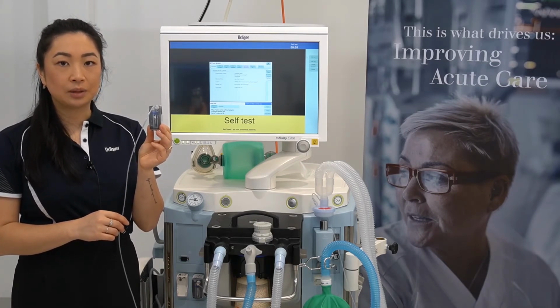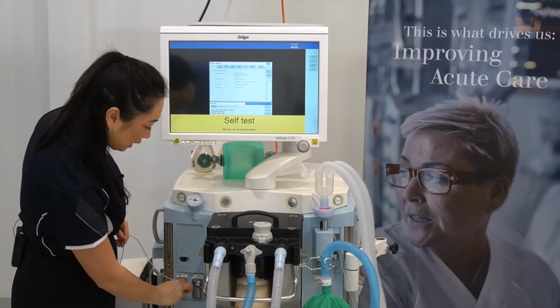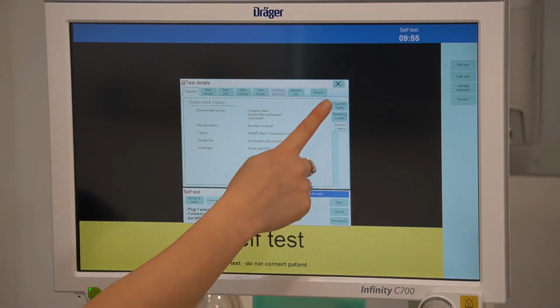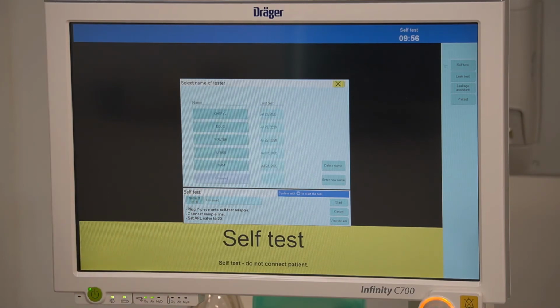Check your manual breathing bag is in place and okay. Ensure that your breathing bag is hanging from the receptacle with the bag pointing downwards. This allows for the pressure in the breathing system to be adequately measured. To check your APL valve is set to 20 millibar, set your APL valve to 20 millibar.